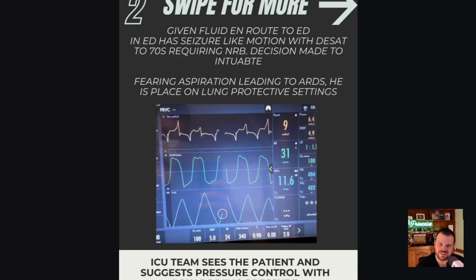Remember that the size of the tidal volume doesn't dictate whether you're going to auto-PEEP because it's not in the equation. I've talked about this ad nauseam, and if you have any questions, you can always ask me where to find that content. But generally speaking, you can fit a 7, 8, 9 mL per kg breath if you have the appropriate settings as far as the rate goes, based on the time constant in a passive patient.